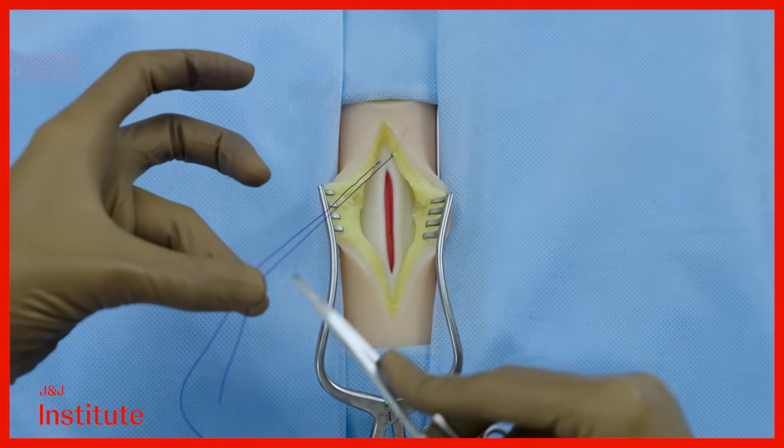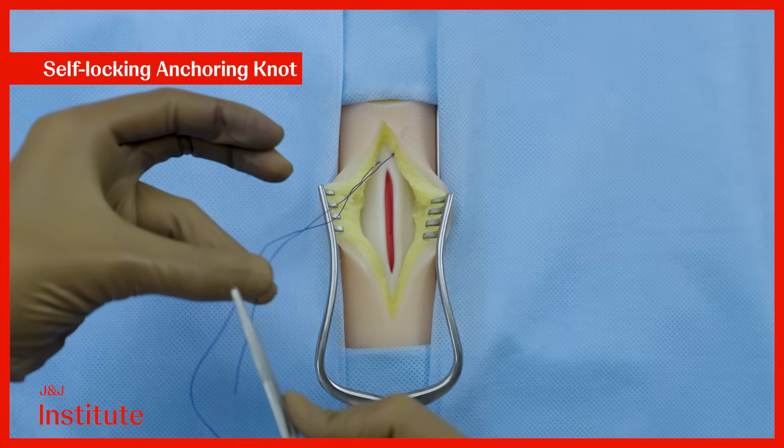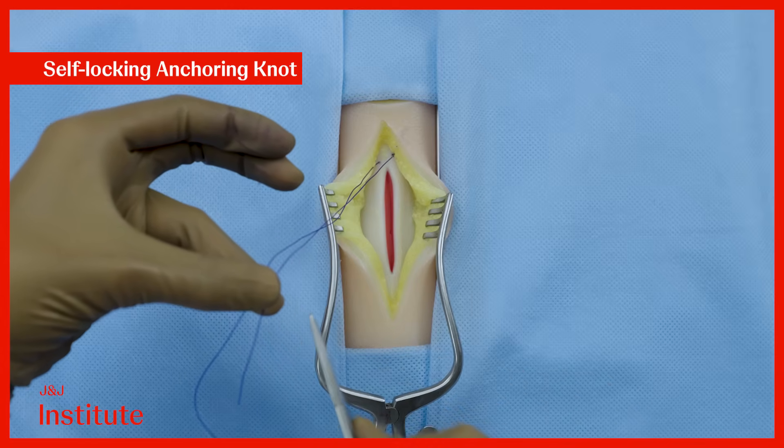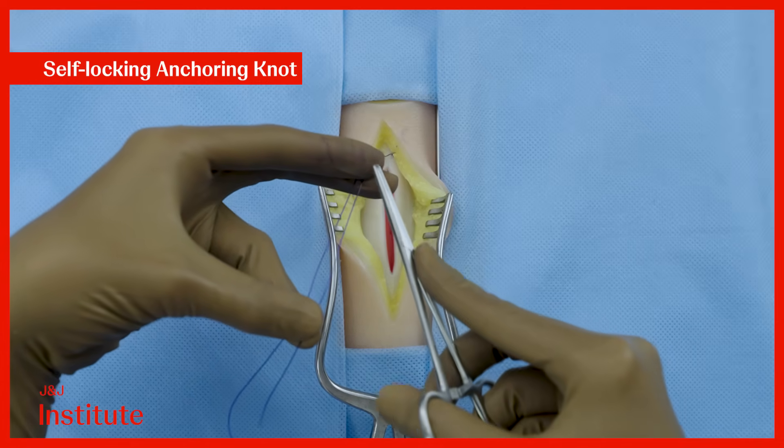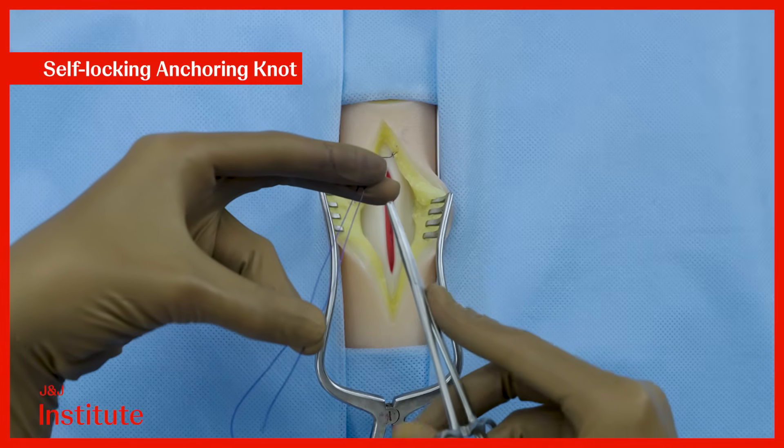Keep the short end of the suture about 8 to 10 inches long and hold it between the thumb and the ring finger in your left hand. Use your index and middle fingers as shown to further stabilize the suture to help you knot.